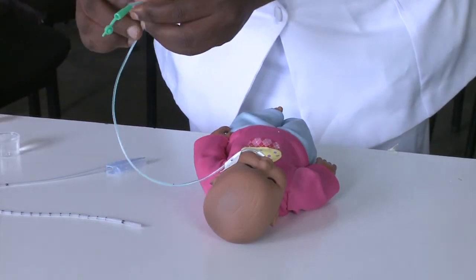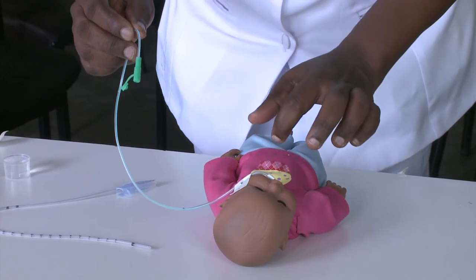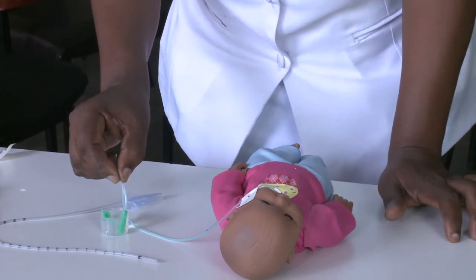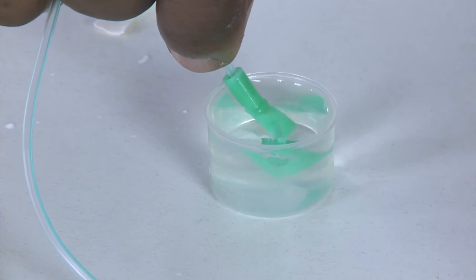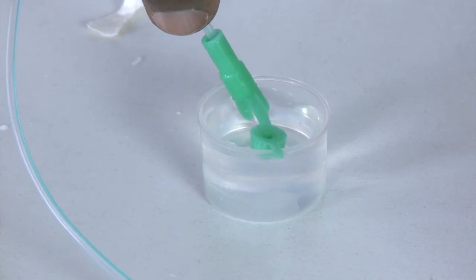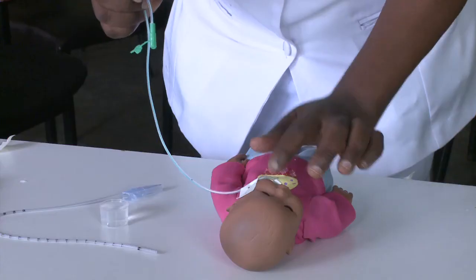And I'll make sure to test if my tube is in the stomach. I've got my water for testing here. There's no bubbling in the water, which means my tube is in the stomach. If there are bubbles in the water, it means the tube is not in the right position. Maybe it's in the airway. You have to remove everything and start again.